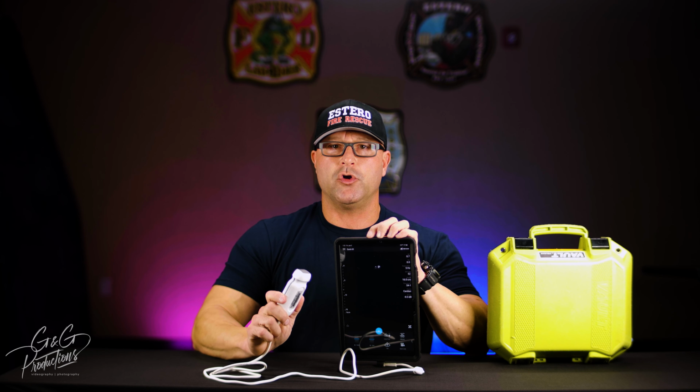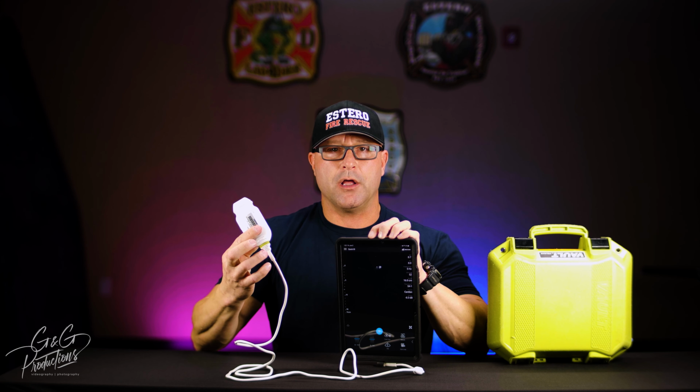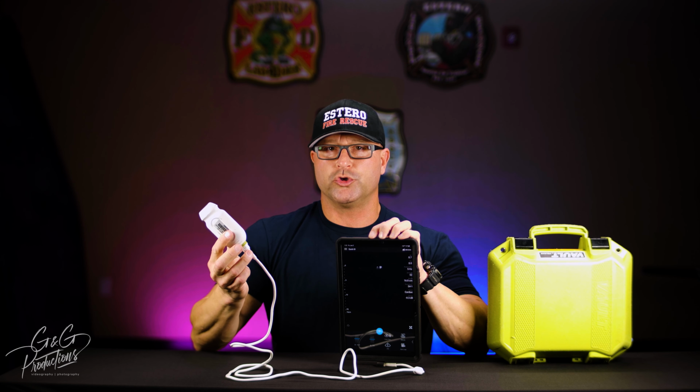Use lots of ultrasound gel. There's no such thing as using too much gel. You can use a lot, and then this transducer will get unplugged, and we'll talk about troubleshooting that later. Number 2, press hard. Think of the probe as a flashlight, and the harder you press, the more light you're going to shine into the patient's cavity, the better image you're going to get overall.